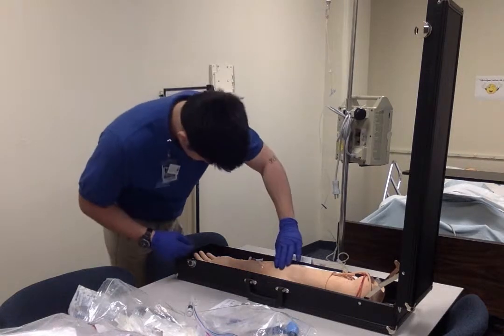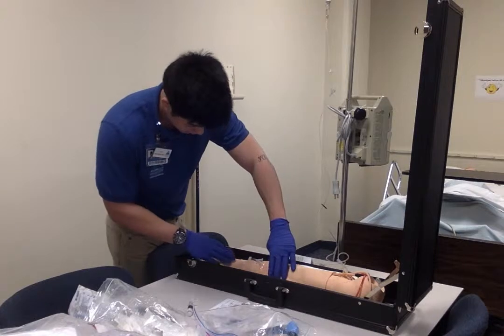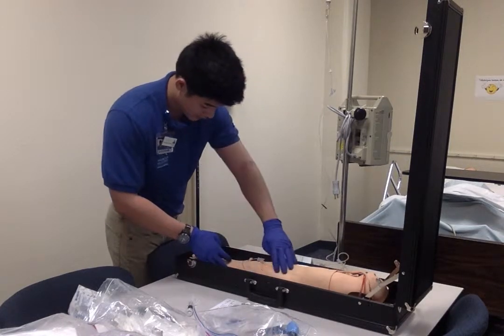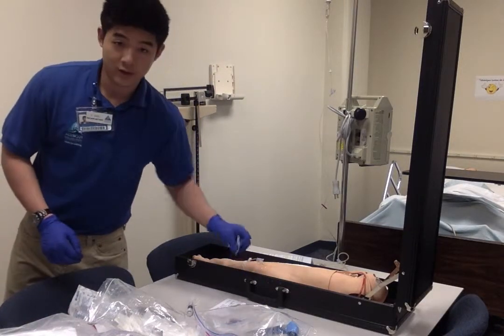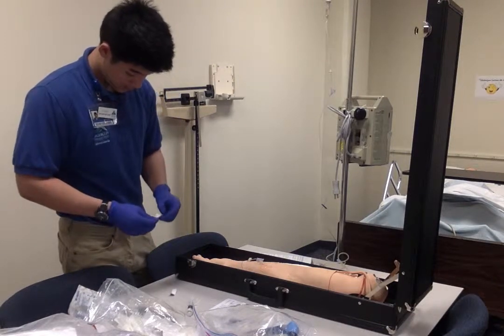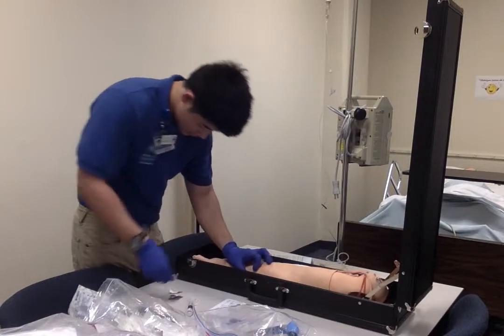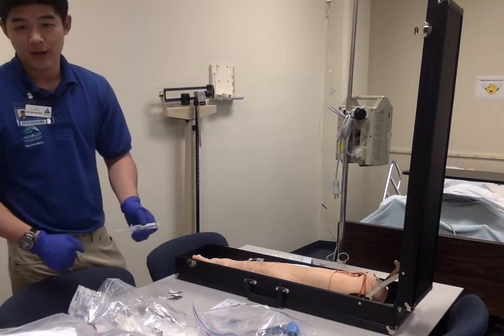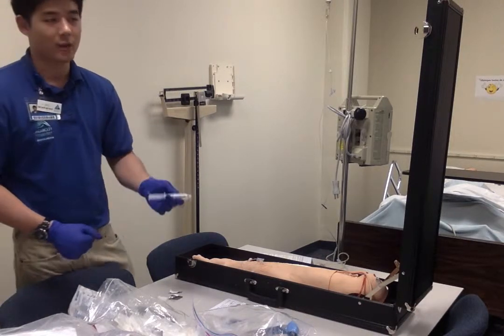Alright, so this is what I'm going to do. Put my gloves on first. I'm going to double check if there is any distension, phlebitis, or infiltration at my IV site. I don't see anything. Okay, so what I'm going to do is clean the port, and do the SASH method, which is saline, administer medication, saline, and heparin.